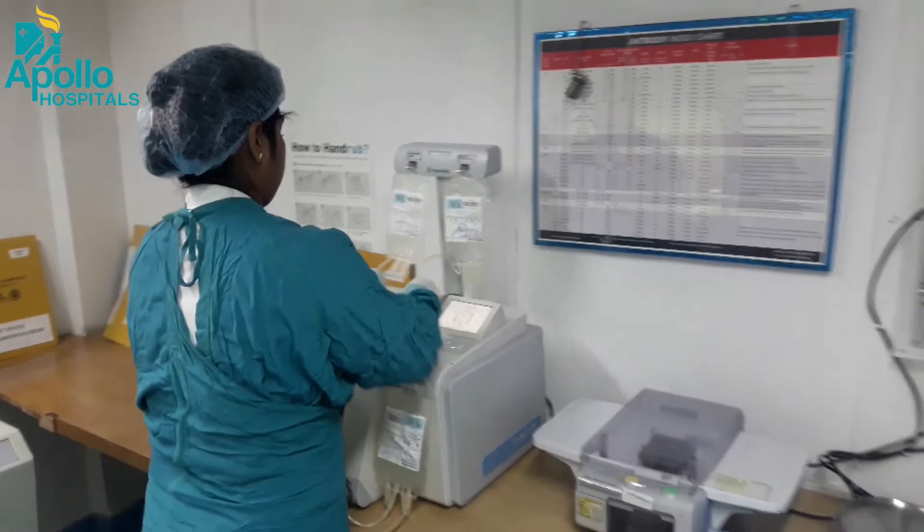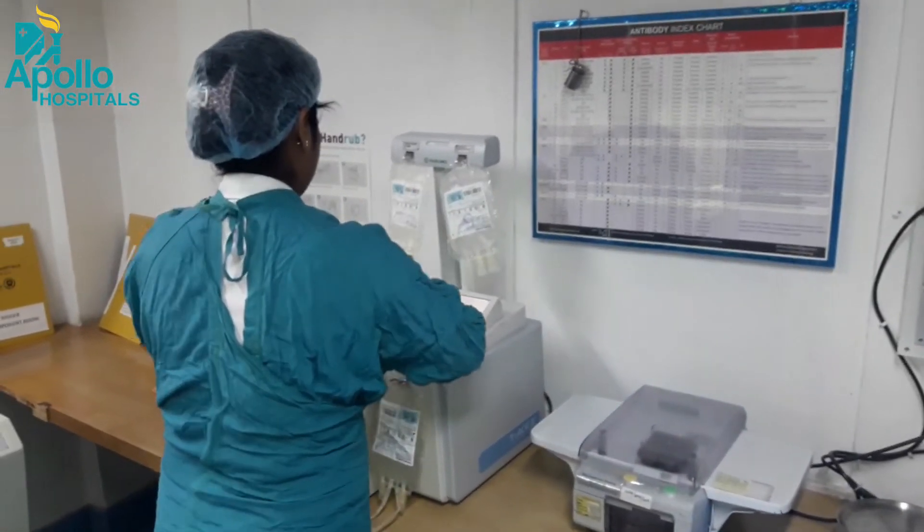This is the machine which is actually going to separate the bag of whole blood into layers of components.